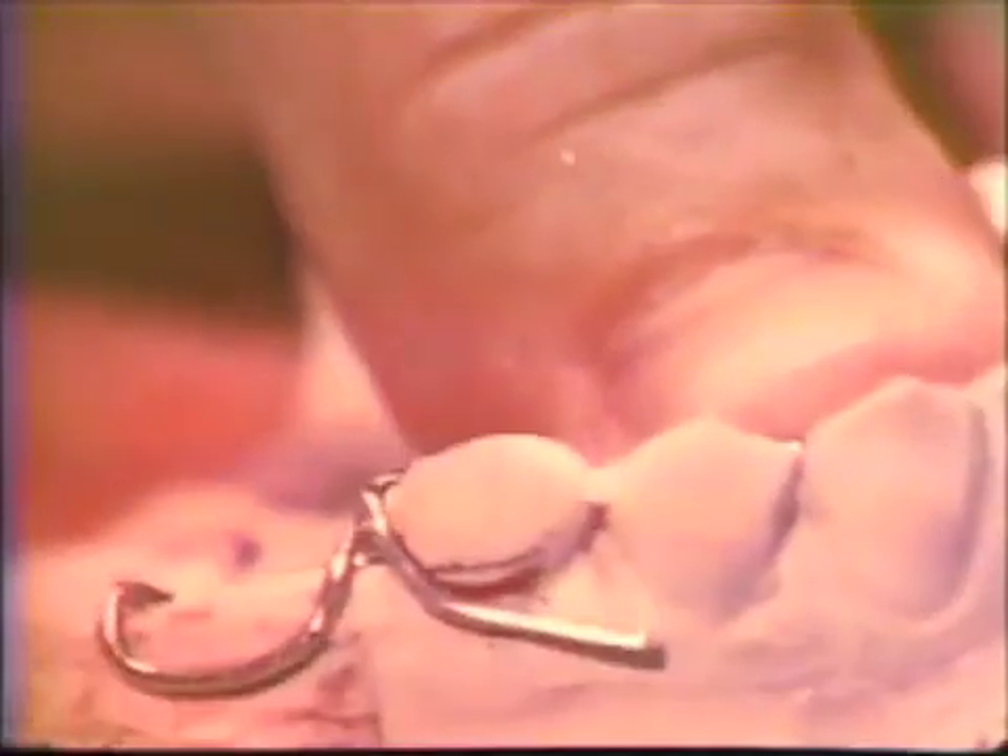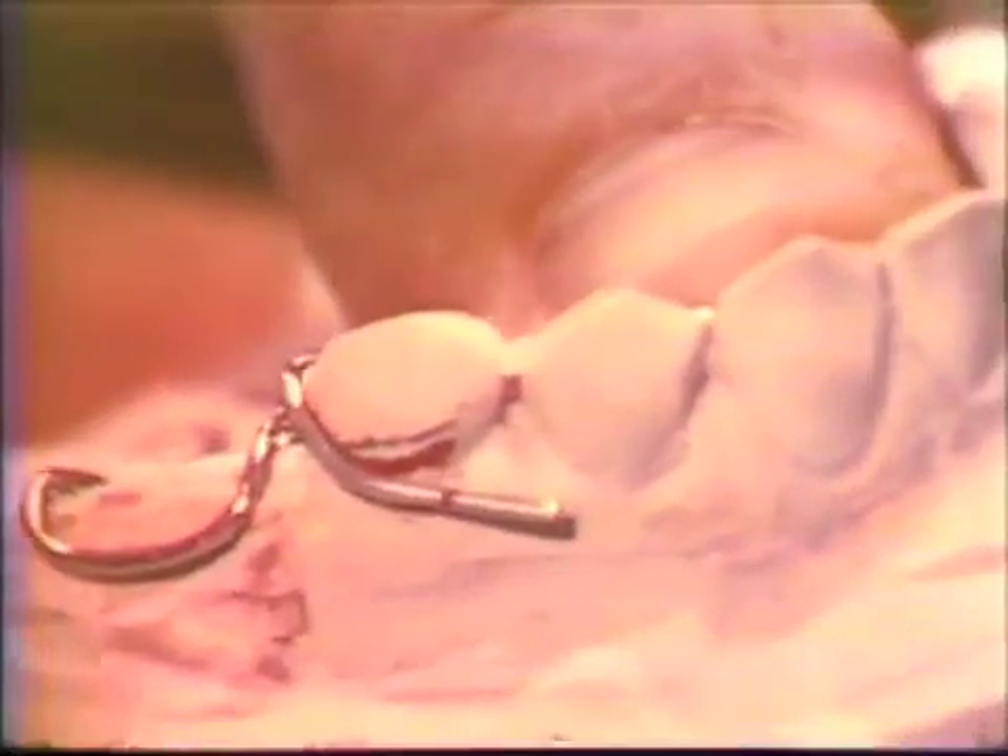By permitting the retentive portions of the clasps to be free of undercuts, the areas that are resistant to complete seating of the rigid framework are more easily detected. Only finger or plier pressure is used for the initial adaptation of the wire structure over the surface of the cast. Any excess length of wire is noted and removed.